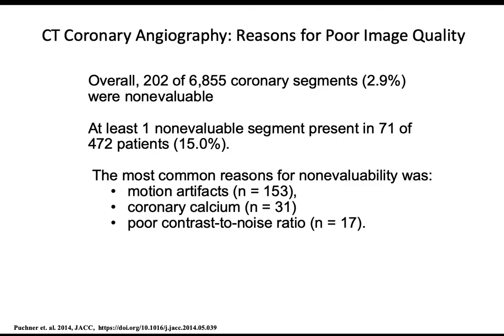Probably the most promising one is to do a dual energy or material decomposition of the scan. The idea is that if you shoot at one X-ray energy, the material's attenuation constant value is just one number. But if you shoot at multiple energy values, the slope of the attenuation is a function of the material that it is. So if you shot at, for example, 5 energy values, you could ask, is this iodine or is this calcium or is this predominantly water? And that would allow you to ask how much of this pixel value is iodine versus calcium and get at it that way.